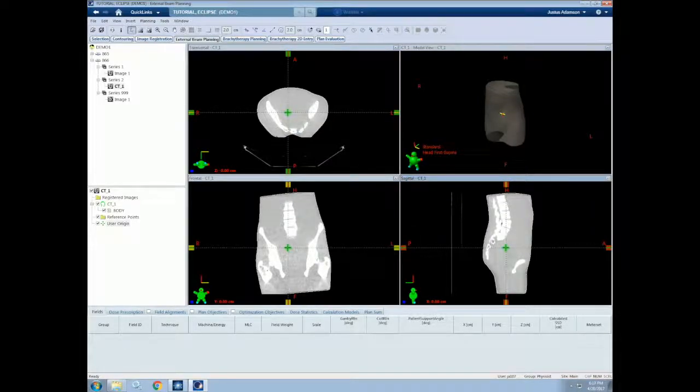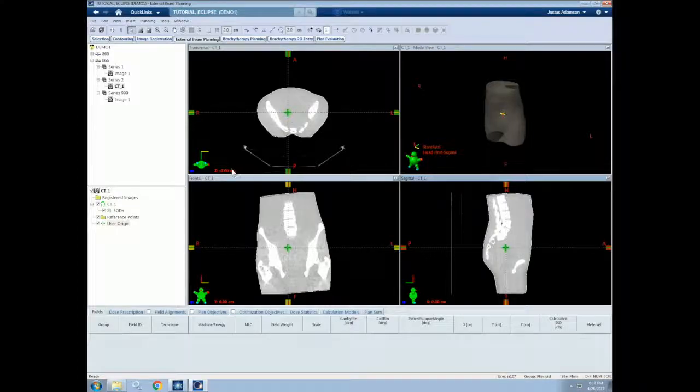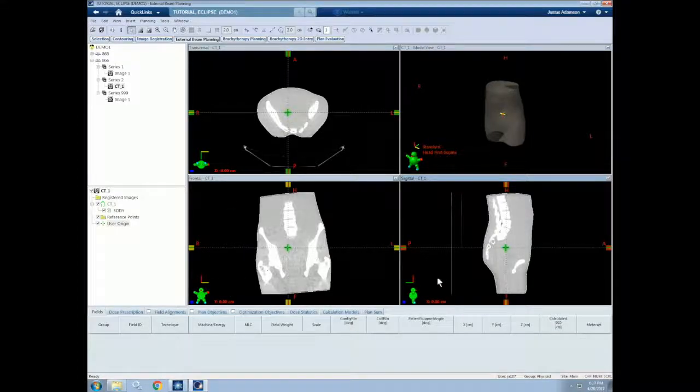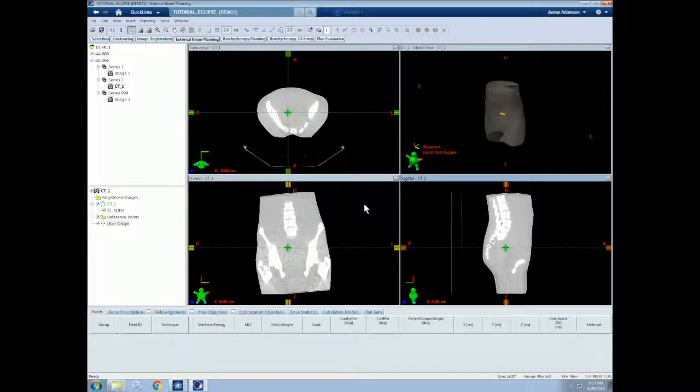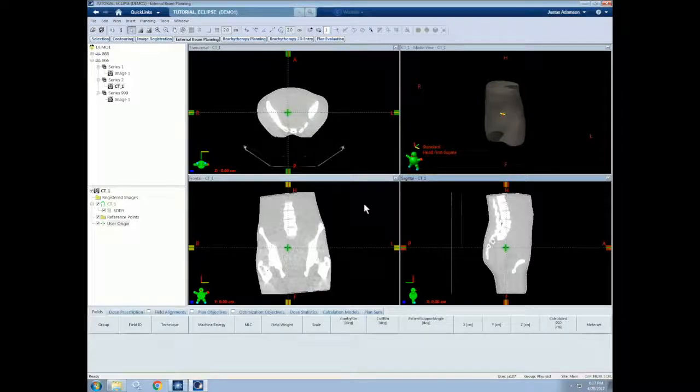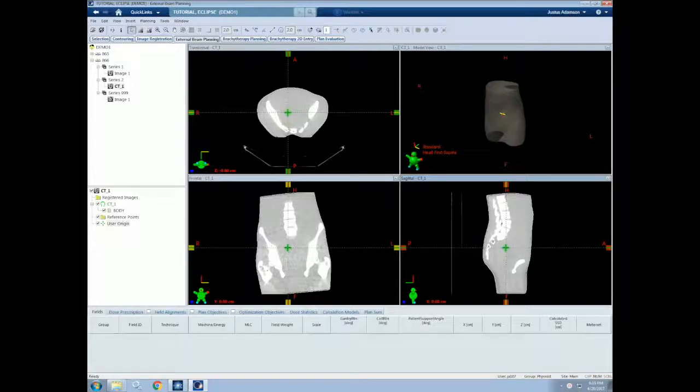As you'll notice, now the coordinates at this location are 0, 0, 0. This will be useful to know for our ISO center shift later on when we create a treatment plan. Now that we have our patient and the necessary images, we can start treatment planning. The first thing we will need to do is create a course.